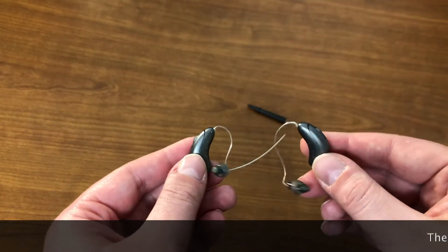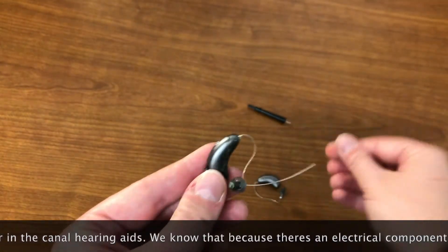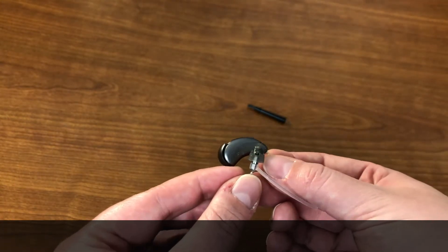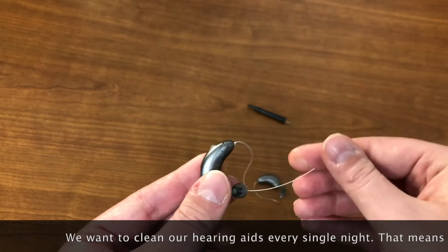These are receiver in the canal hearing aids. They are called receiver in the canal hearing aids because they have electrical components that go behind the ear and that go in the ear. We want to clean our hearing aids every single night.